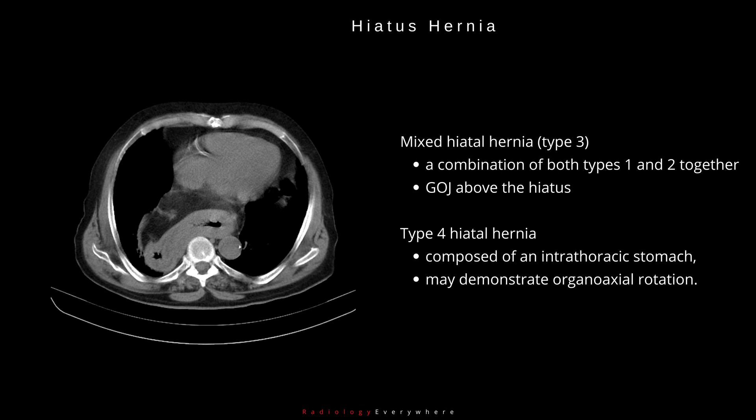Type 4 hiatal hernia is composed of an intrathoracic stomach, which may demonstrate organoaxial rotation.